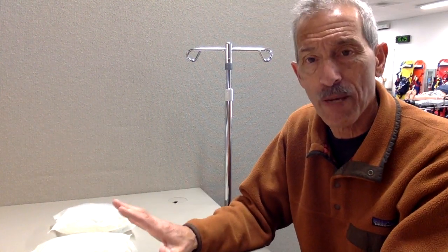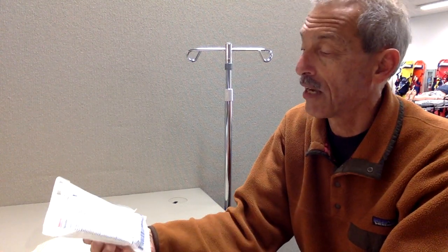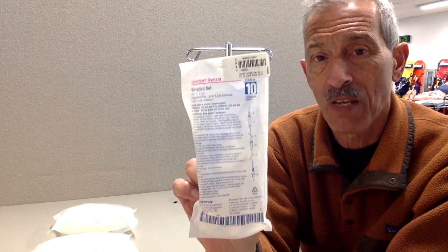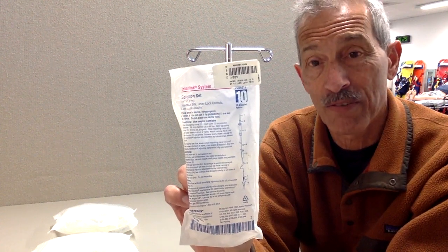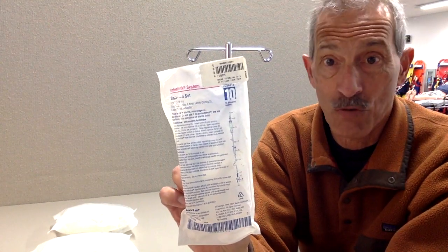There are two drip chambers or drip sets that we use out in the field. The first one is a 10 dropper — 10 drops per milliliter. This is called a maxi dripper, so it provides the maximum amount of flow, the quickest amount of fluids to the patient as possible. If you attach this dripper to a 1000 cc bag of fluid, you can empty the bag in about 10 or 15 minutes. This is for someone who's having traumatic injuries, blood loss, or low blood pressure.